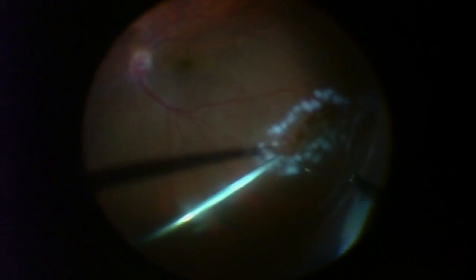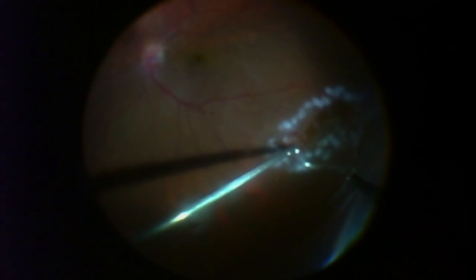I apologize for the quality of the video — we actually forgot to turn on a filter. Now you can see that I've gone around the tear and treated it. I want to get one little edge on the left and treat it a little bit better, which is why I'm removing more fluid. And there I'm performing the extra laser.